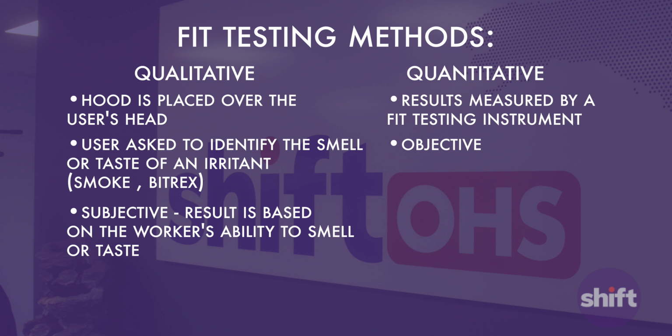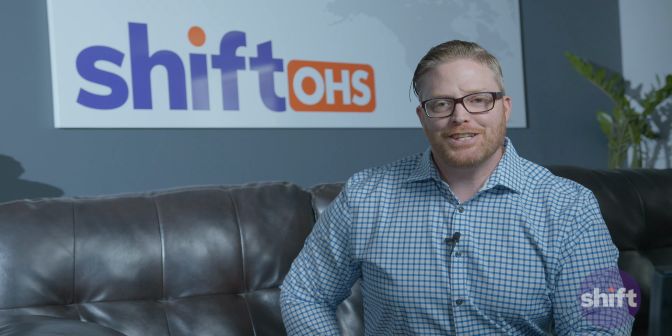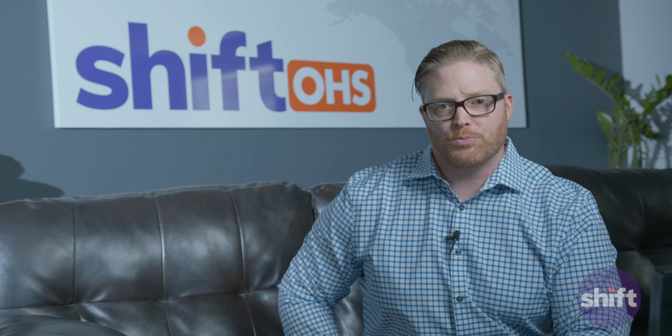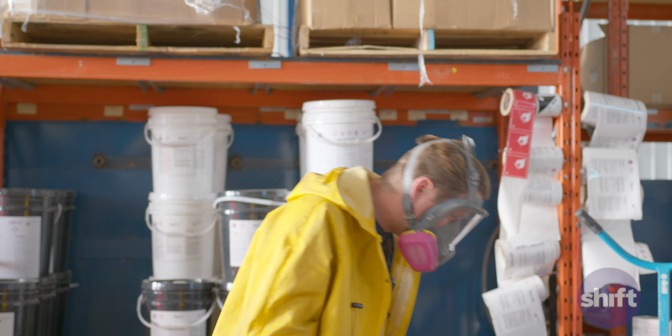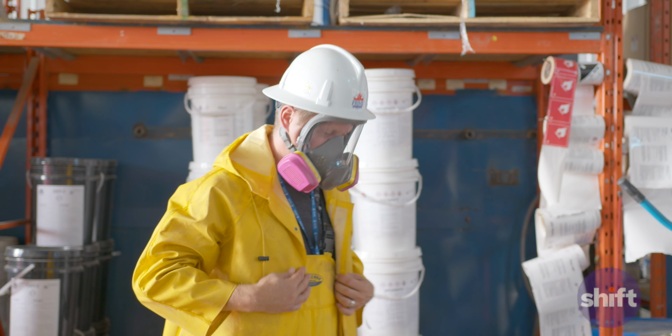While both qualitative and quantitative fit tests have their place, Shift OHS recommends completing quantitative fit testing where possible to ensure an objective, measured result. In addition to the fit test, a respirator user should also be assessed for any medical or mental health conditions that would preclude them from safely wearing a respirator. After all, if a worker's respirator is properly sealed, but every time he puts it on, he has a panic attack, how useful is it?